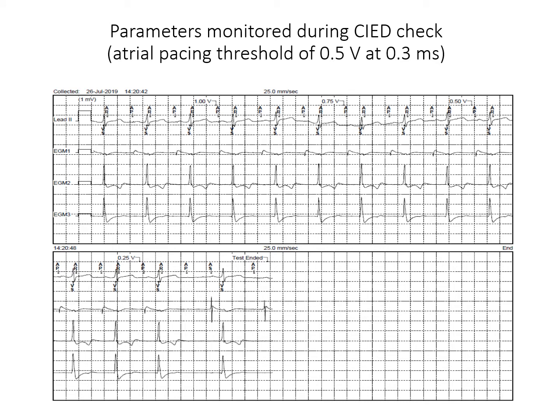The figure shows the assessment of the pacing threshold in the atrial channel. The AP marker means atrial pacing, while the AS marker indicates atrial sensing. In the context of pacemakers, the pacing threshold means the minimum amplitude of the impulse that must be delivered to the myocardial chamber at a constant duration to induce cardiac chamber electrical activity.